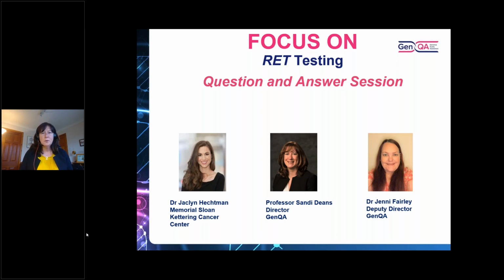A couple more questions for you, Jaclyn. We'll stick with you. So Pauline, hi Pauline. Is it possible to increase the amount of tissue sent for testing? Many of the NGS panels require significant amounts of DNA and RNA that is not possible to extract, so we sometimes revert back to FISH. Is that something you experience in your clinic?